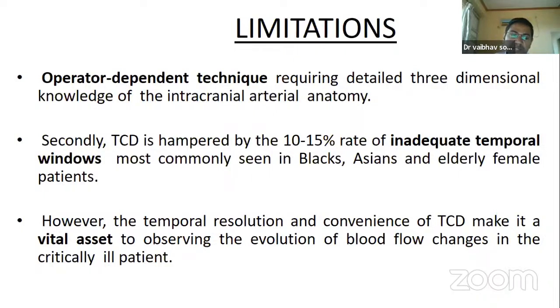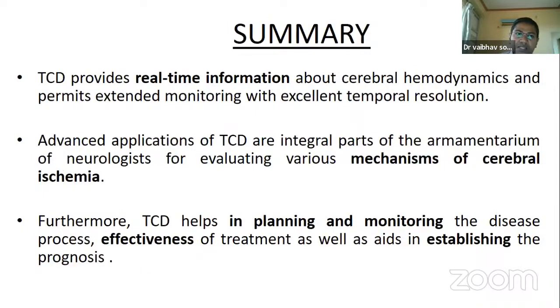However, the temporal resolution and convenience of TCD make it a vital asset for observing the evolution of blood flow changes in critically ill patients who cannot be shifted to the MRI or CT scan machine. In patients who are on a ventilator, we are able to get important vital information via TCD. Now the summary.